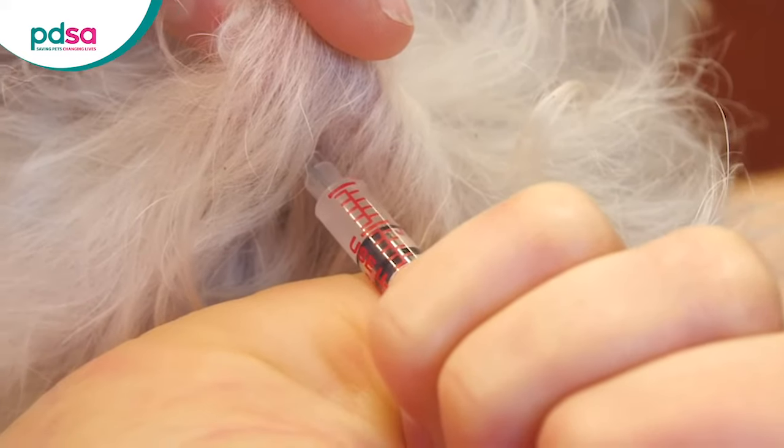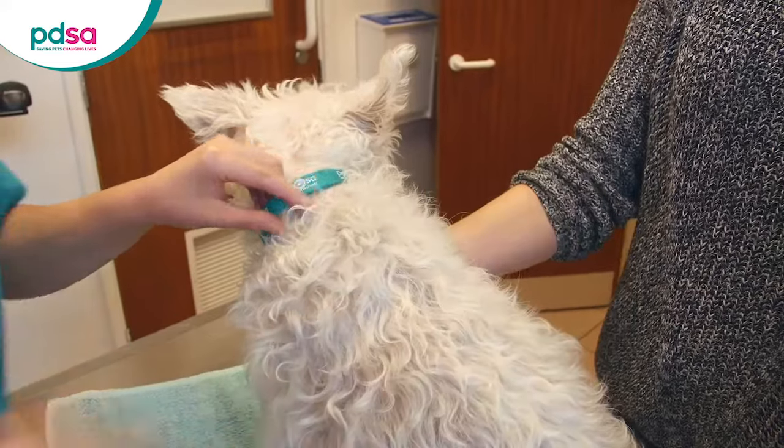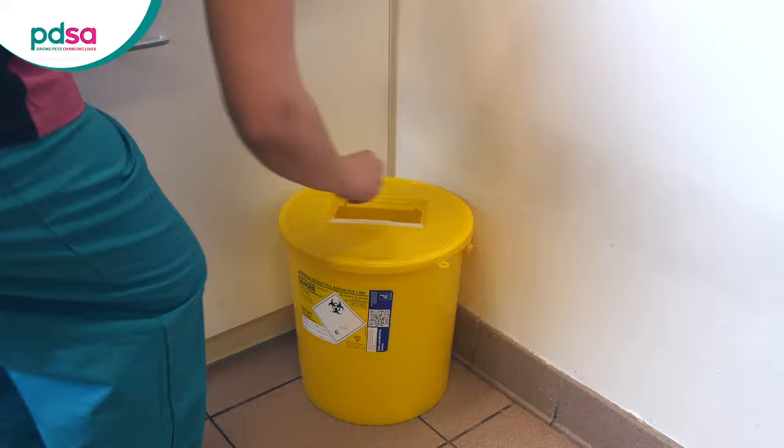If there's no blood when you draw back, press down on the plunger and inject the insulin into your pet. Carefully remove the needle afterwards and pop it into the sharps container. You can gently stroke the area afterwards.